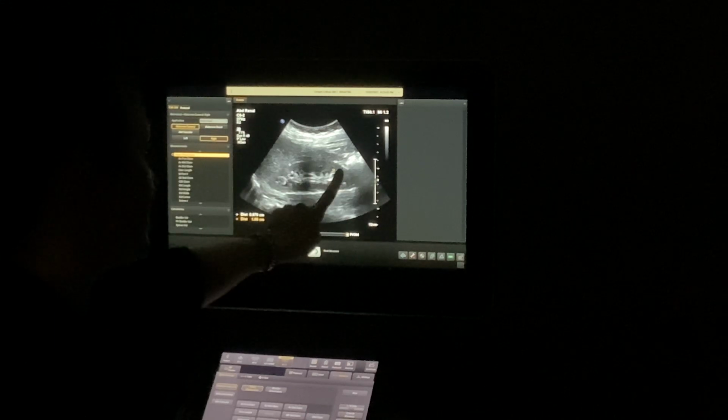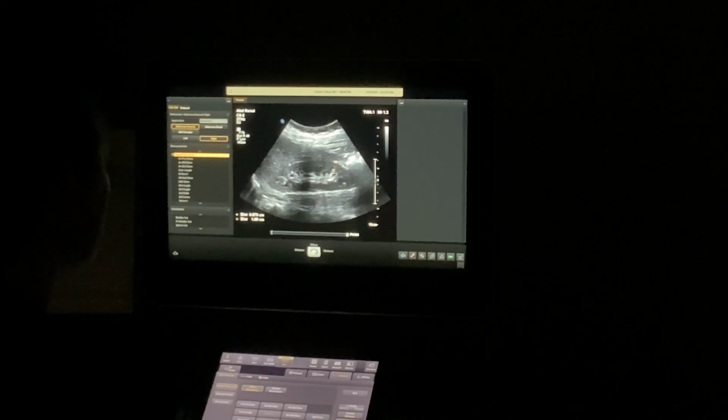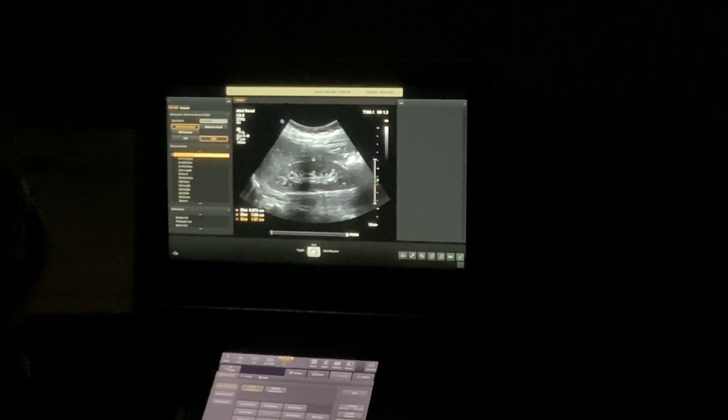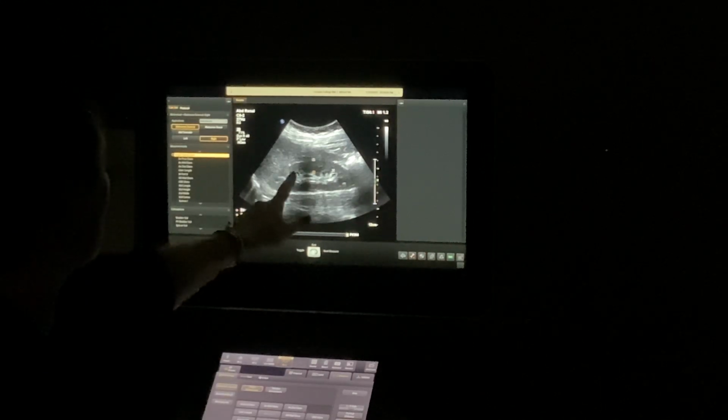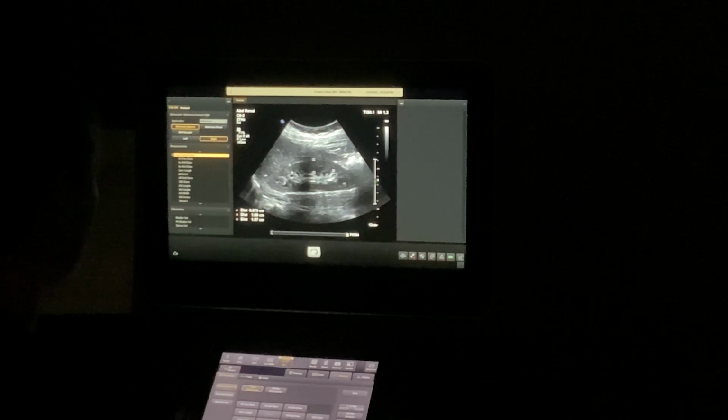You can measure it here, or you can measure it here. I would not measure it here. And why would I not measure it here? Because it's the middle and will be folded. Not necessarily. You don't have a clear border? It's not clear, okay? I can clearly see the margins where the cortex meets the sinus here. So this is that edge, and this is that edge. Do I see a clear margin here? Let me take all those off. Where I can measure? This would be falsely representing the cortex here, because you see how it's thicker here than it is over here? Yes.